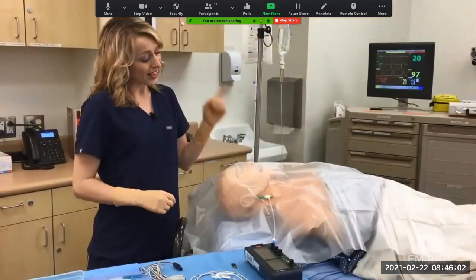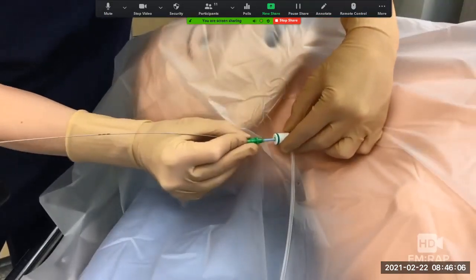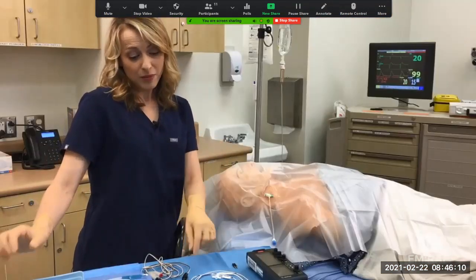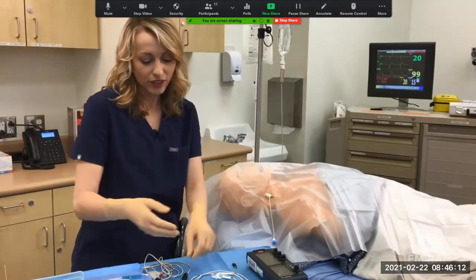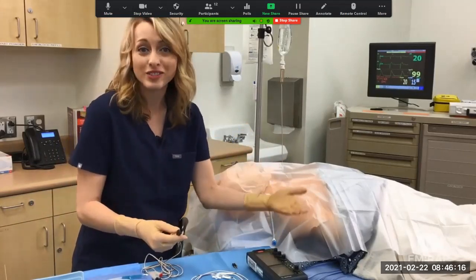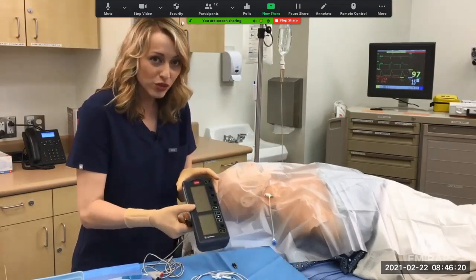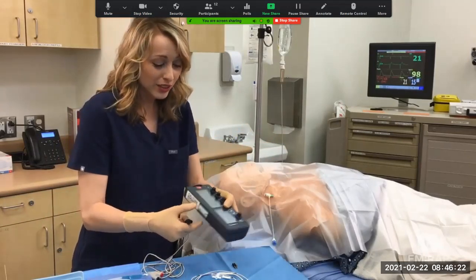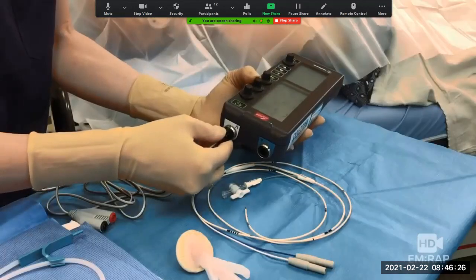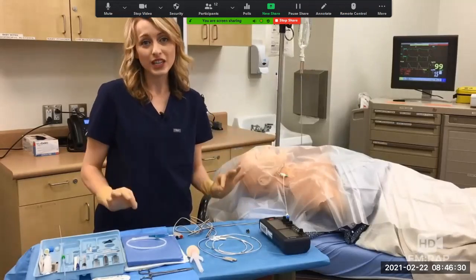Once you've got your cordis in the IJ, now you can remove the wire and the dilator. You can do this all in one motion. Plug the connecting cable into the pacing generator. This is typically sterile. This is not. So you want to have a non-sterile assistant help you with this. Ours can actually be atrial or ventricularly paced, but we're putting this in the RV, so I'm going to plug this into the V.